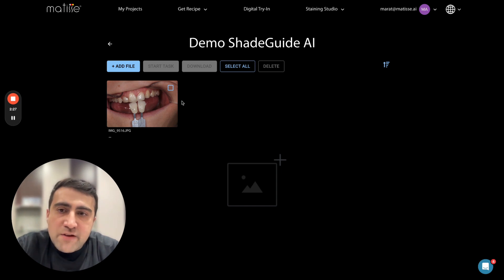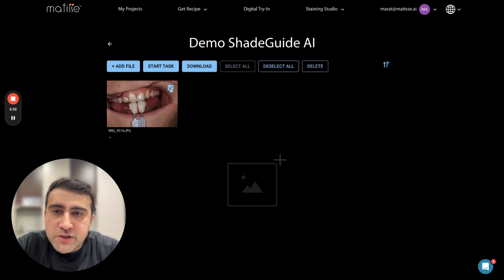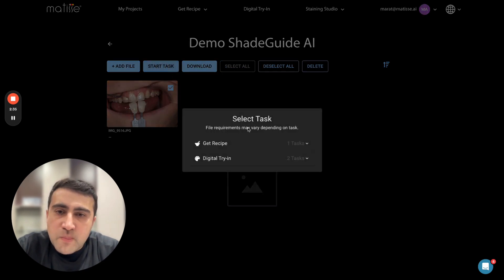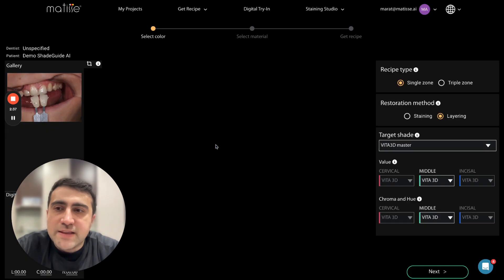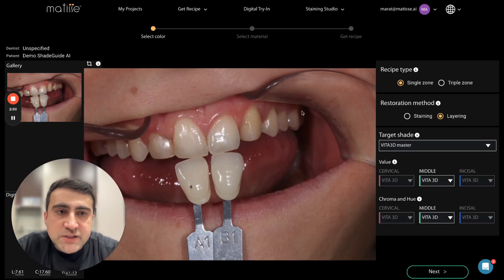I already have uploaded my picture — it's a JPEG photo. I select the picture, then click on 'Start Task' and 'Get Recipe Shade Guide AI.' Now we are in the Shade Guide AI page.